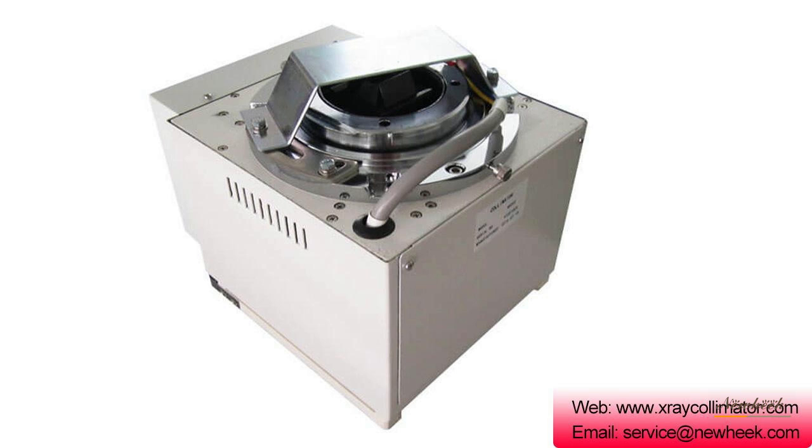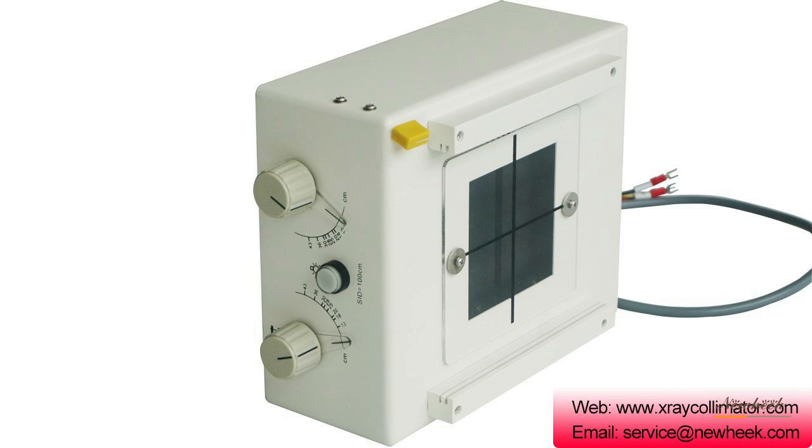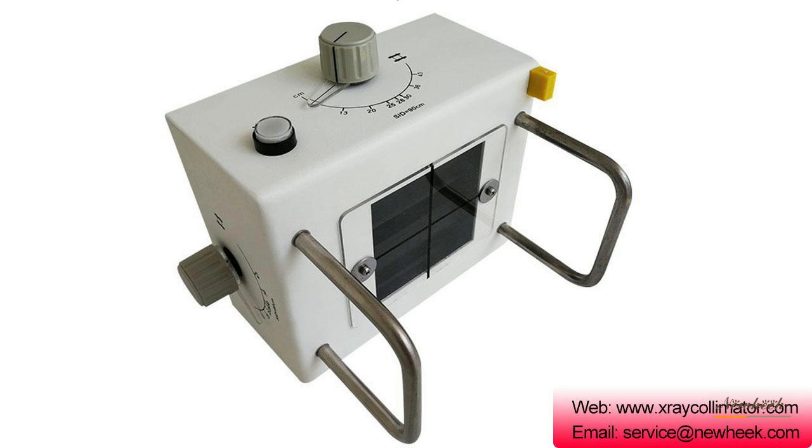A manual x-ray collimator is a medical x-ray machine component that can be mounted at the exit of an x-ray tube sleeve window to block x-ray scattering lines, reduce x-ray damage to patients, improve imaging quality, and limit the x-ray field of view to the required range.